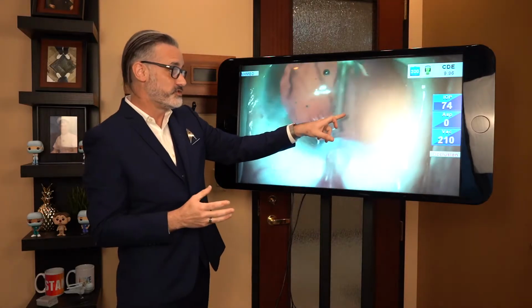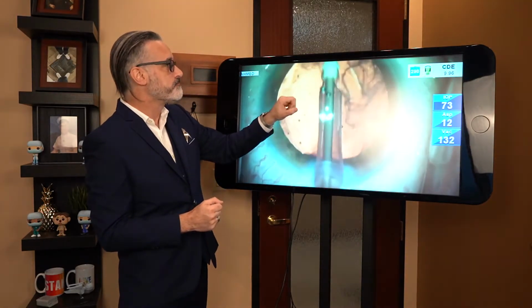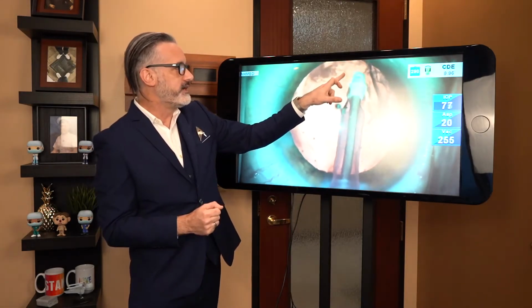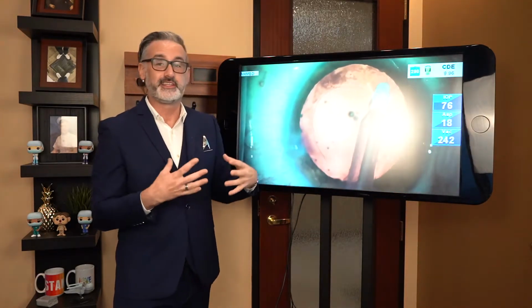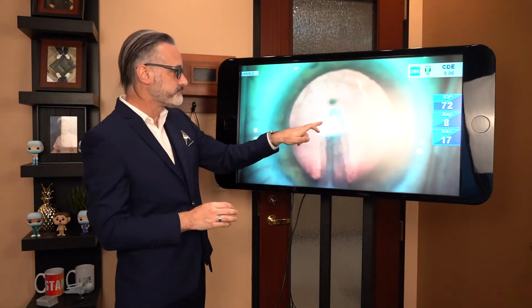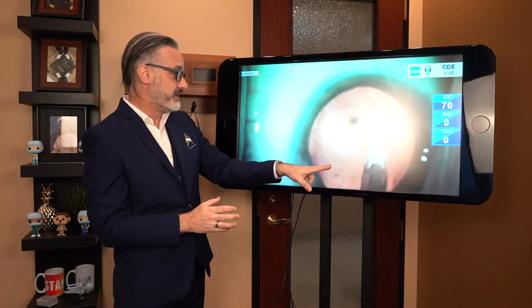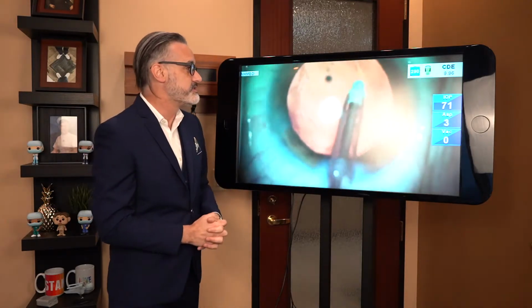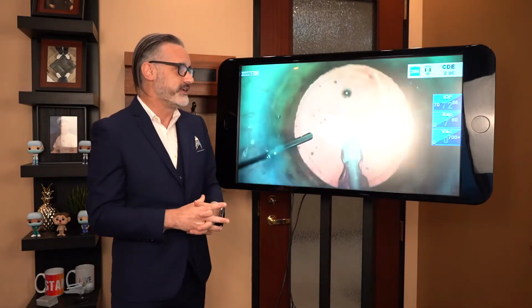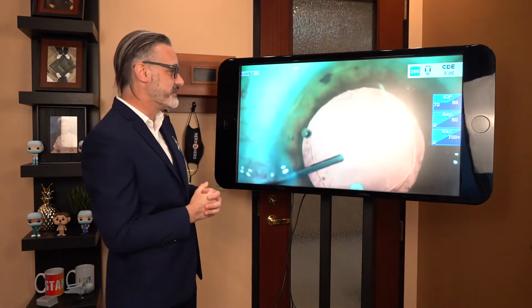So the doctor then just switched out the vacuum tools, more of a finite one at the end, to be able to get all around, because every part of the original lens that had the cataract in it does have to be removed before the new one can go in. And so we have that vacuum suction there, making sure that all the little bits and pieces were removed. So then there's not an extra little bit of possibly lens left over there.